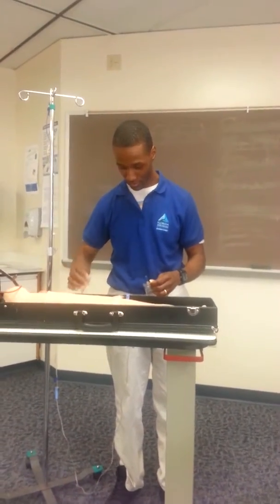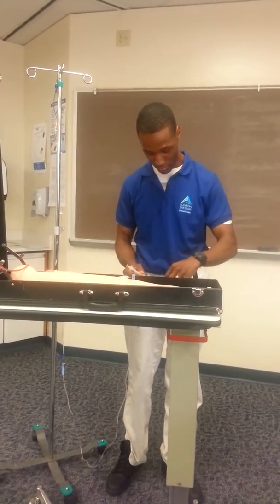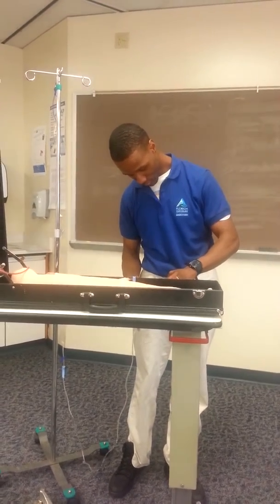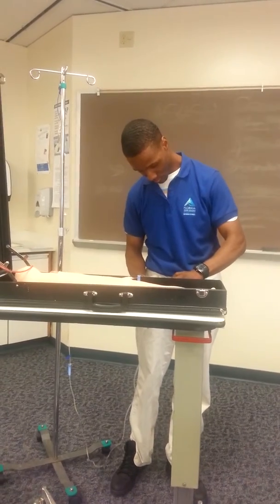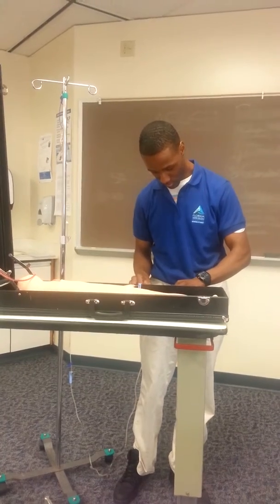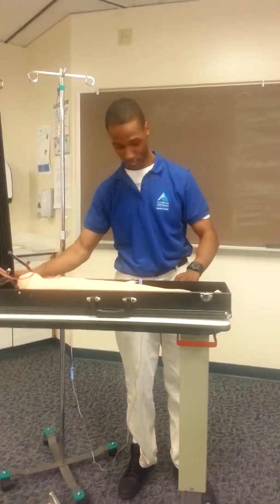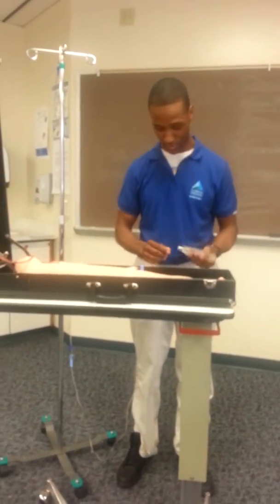Take my medication. Uncap. With my blunt needle, I'm going to insert. Inject my bag. Take it out. Dispose of my needle in the sharps container. Mix my medication.